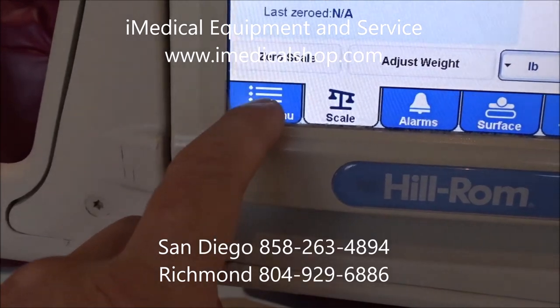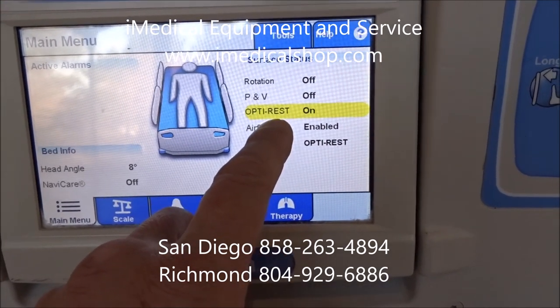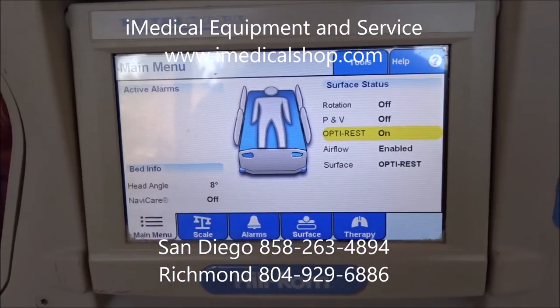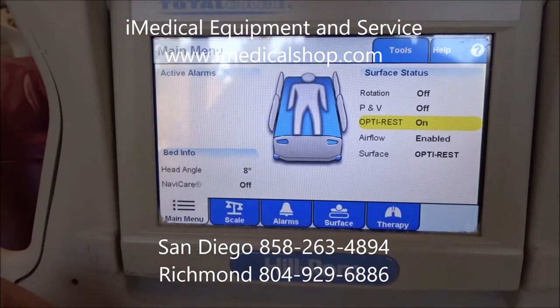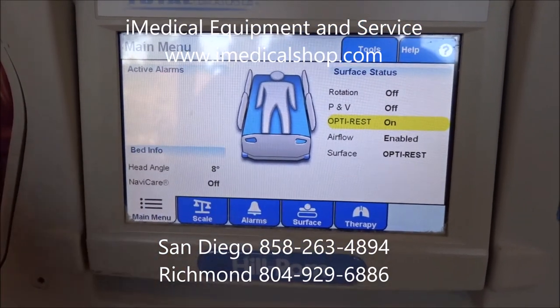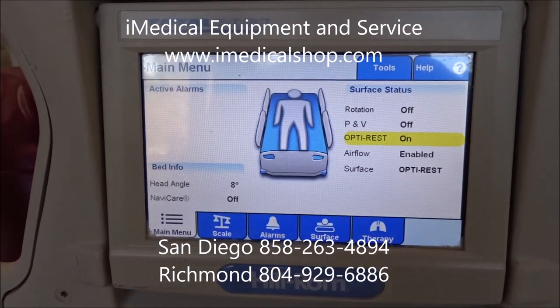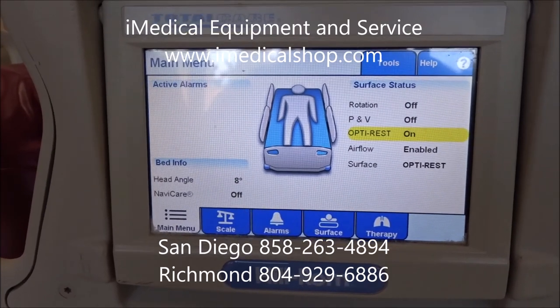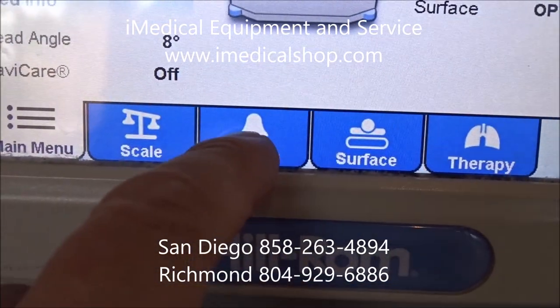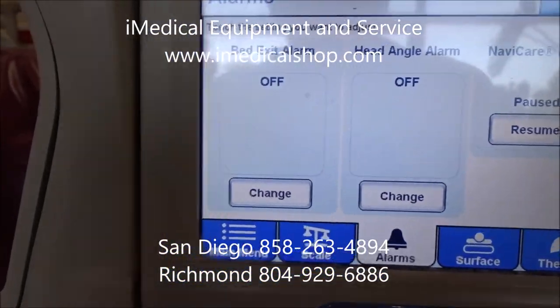The main menu gives you a general overview. OptiRest is a very important feature — it runs almost like a wave of air through the bed, changing the pressure points on the body. I suggest running the OptiRest feature if the patient is comfortable with it. Bed exit alarms are mainly for hospital use, though they can also be used in home settings.